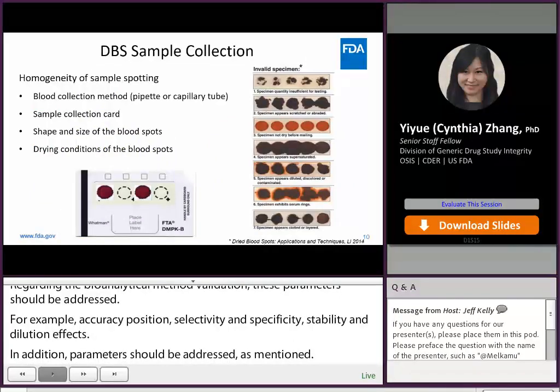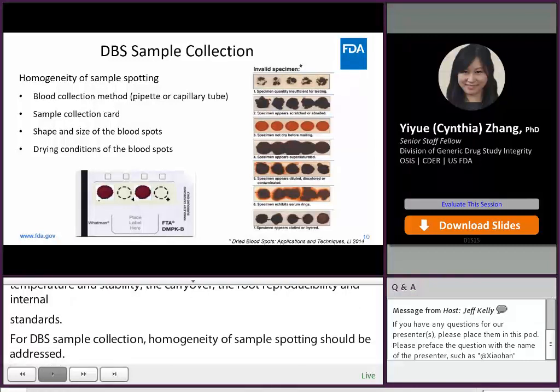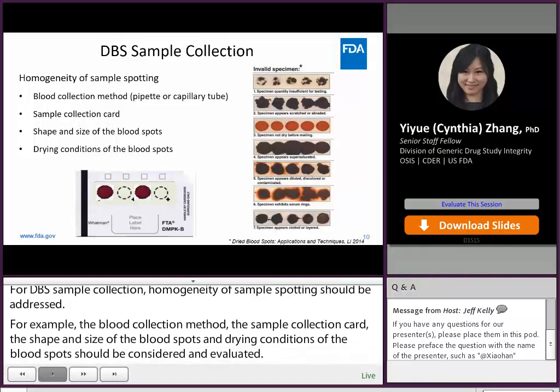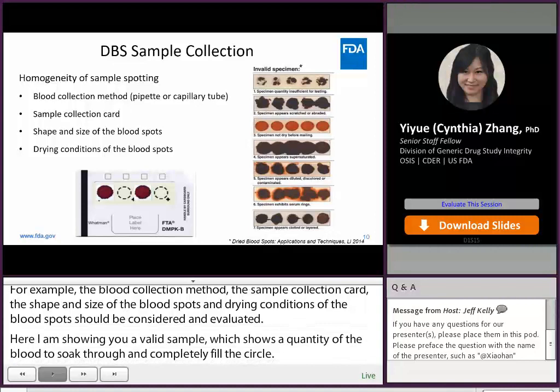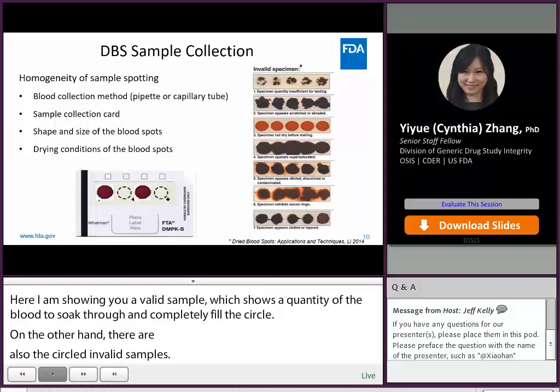For DBS sample collection, homogeneity of sample spotting should be addressed. Factors to consider include the blood collection method, sample collection card, shape and size of the blood spots, and drying conditions. A valid sample includes a sufficient quantity of blood to soak through and completely fill the pre-printed circle on the collection card. Invalid samples include those with insufficient quantity, too much blood, samples not dried before shipping, or samples that appear supersaturated, diluted, discolored, or contaminated.